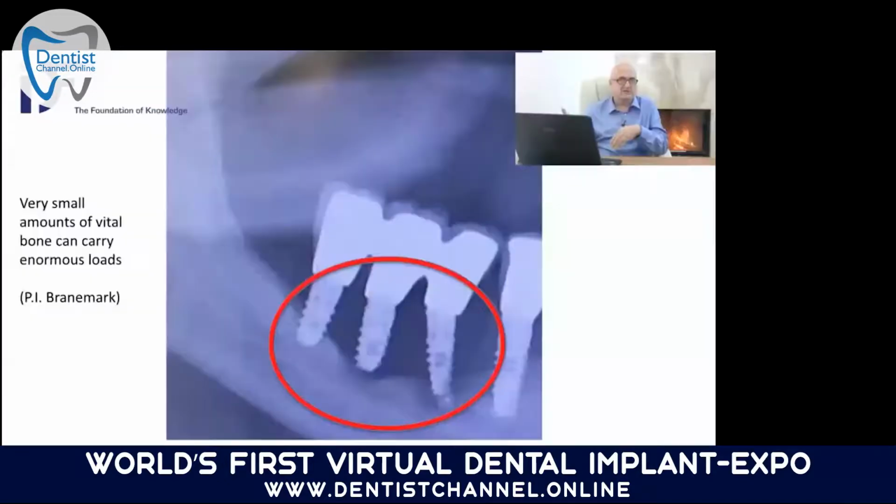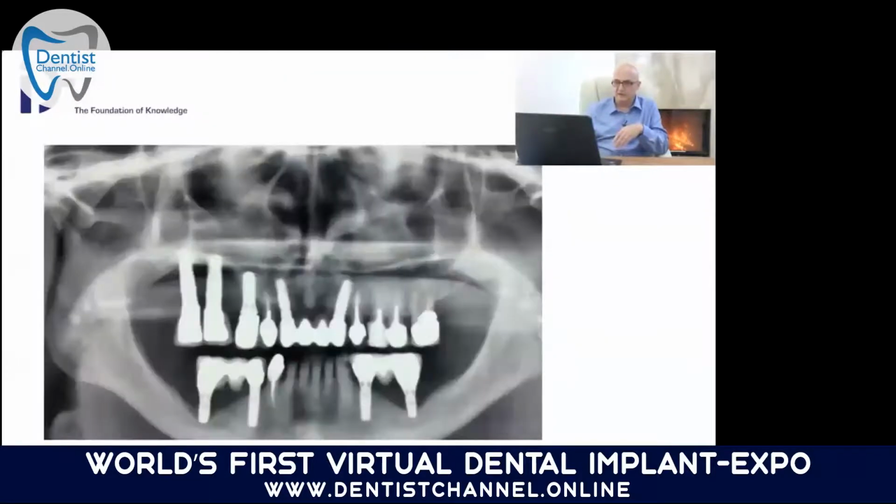So I have to ask the question, why are we then sandblasting and acid etching implants if this works? I mean, we see this every day. It's basically the same story here. We see this every day.